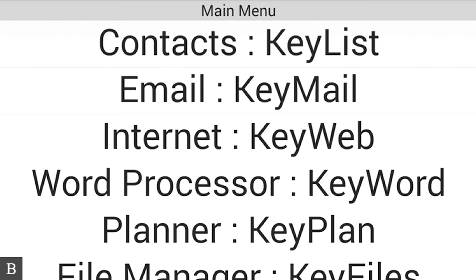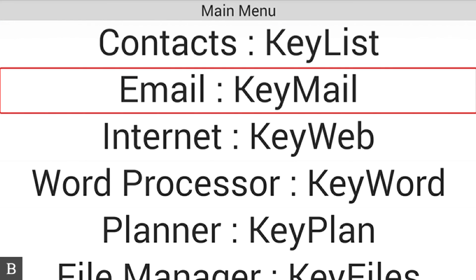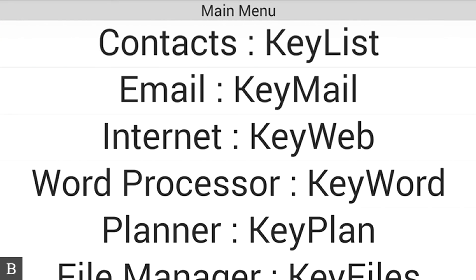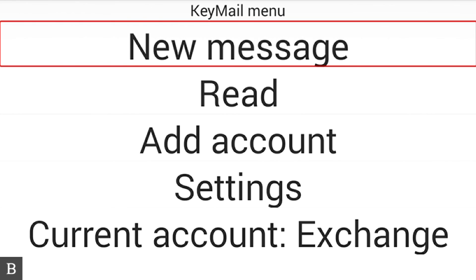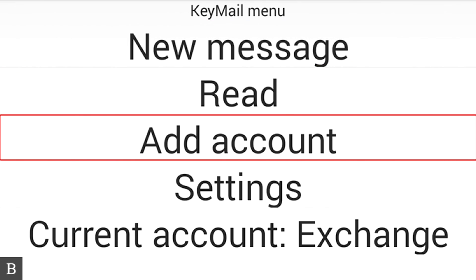From the main menu, I'm going to jump to the top with Space+123, and I'm going to press E for email, just like we always have, and press Enter. I'm at the Keymail menu, which shows New Message. I'm going to hit my next thumb key to jump through the items — I can read my messages, or I can add another account.